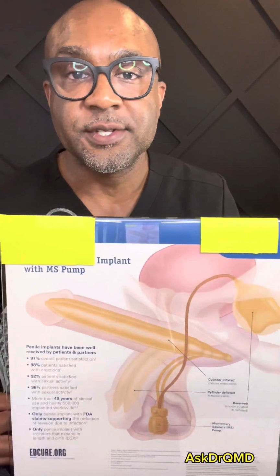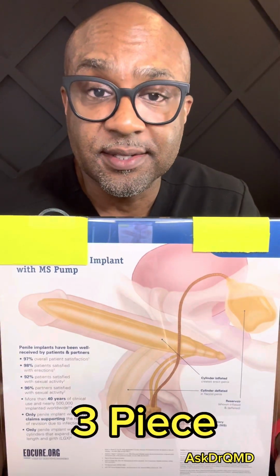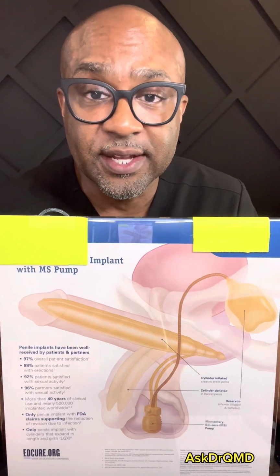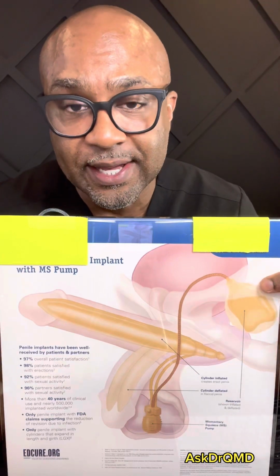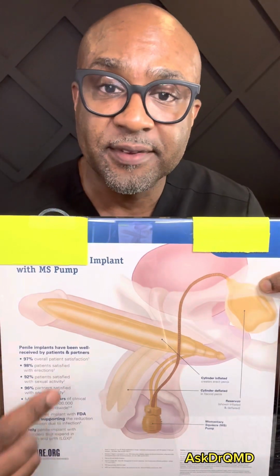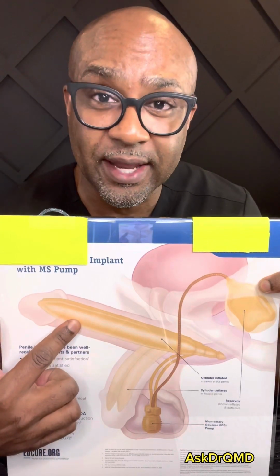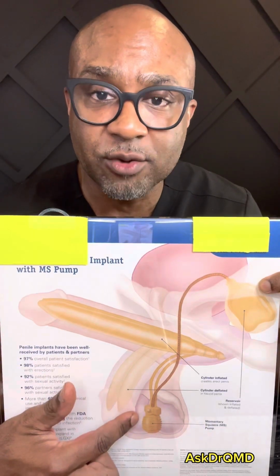The first prosthetic is the three-piece prosthesis. Now, this is considered the Cadillac or the gold standard. So it is made of three components. You have a reservoir right here that sits behind the pubic bone and in front of the bladder. You have cylinders, and actually two of these, one to go in each erectile body. And then you have a pump that fits inside of the scrotum.